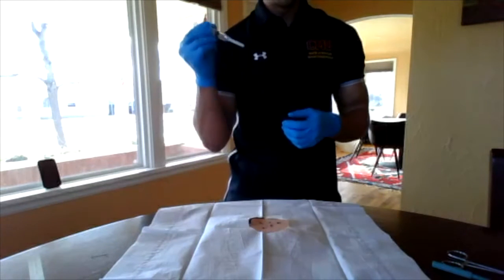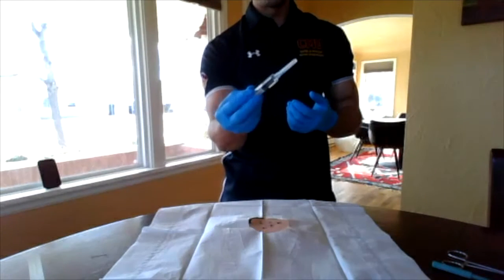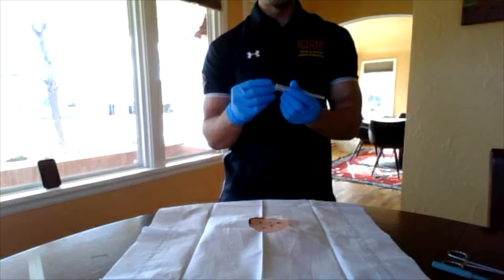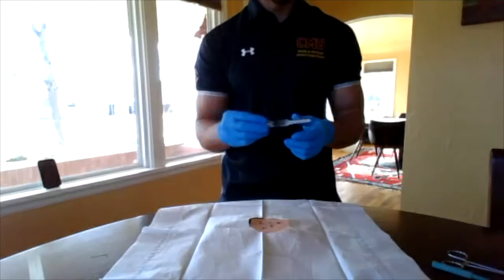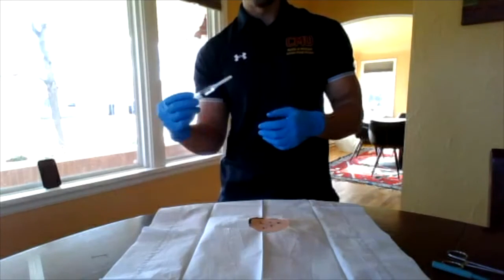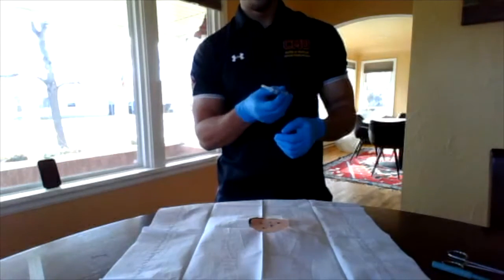And so as you're doing this, you want to go in and you want to try to go into the other side of the lesion. And then as you're doing that and you're coming back, you're going to pull back and you're going to continue to inject the medication as Professor Ousley encourages us to do, just to get a greater area of the anesthetic. And as you pull back, you're going to change directions and go into the opposite way. Then pull back, change directions, inject, and then remove it.